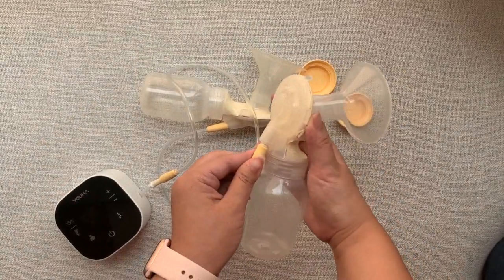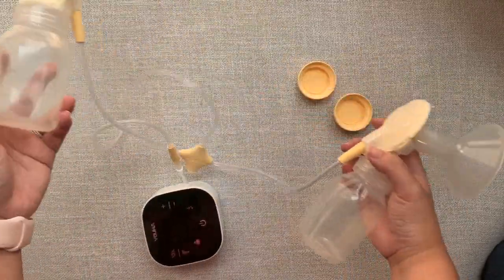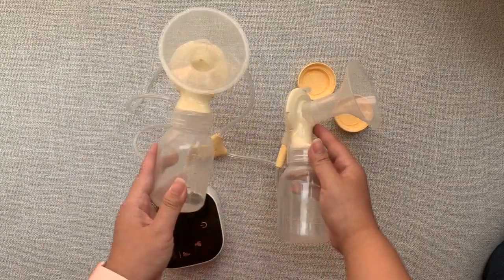one will go onto the other side, and then you have a double breast pump.